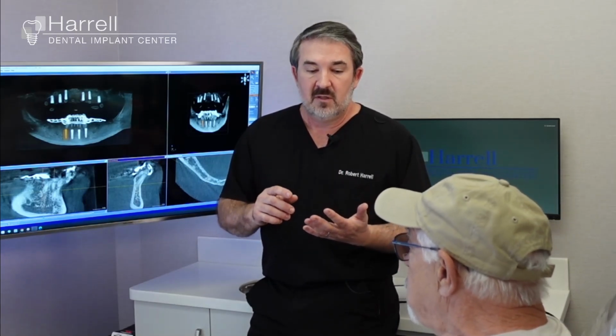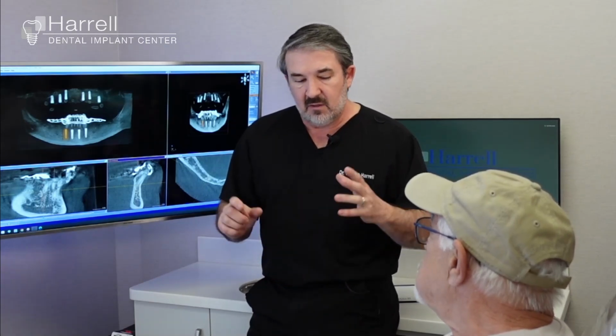That's building the surgical guides, which are a really important part of the process, the prosthetic teeth that will go in the day of surgery, and all of our mapping that we need to guide that surgery. The first visit is the diagnostic records. You've already done that. We've already done your case planning. We get on the computer and go through the software modules to plan your case.